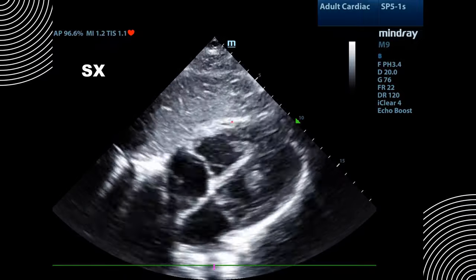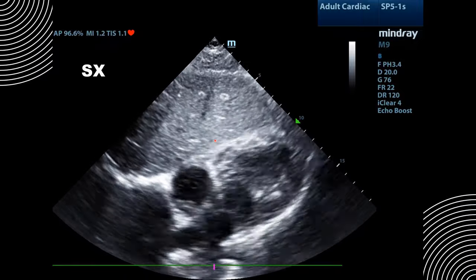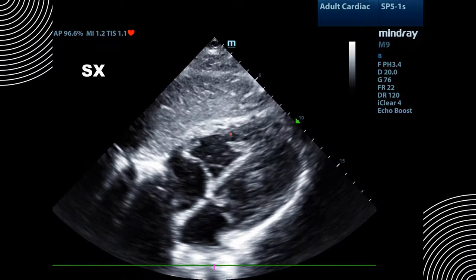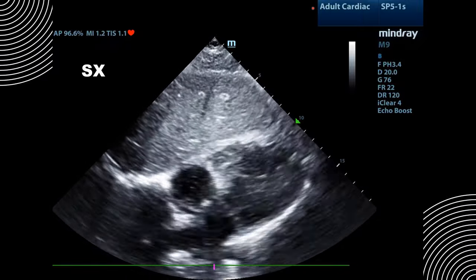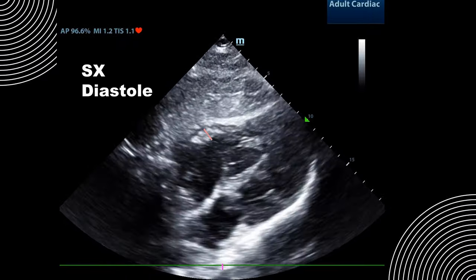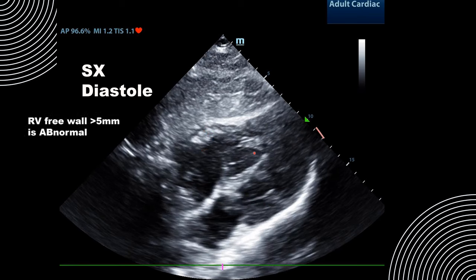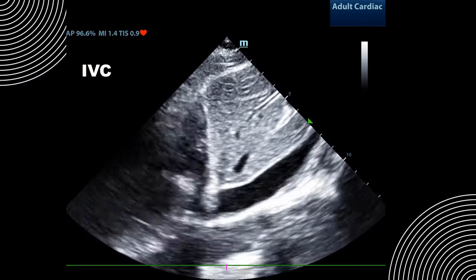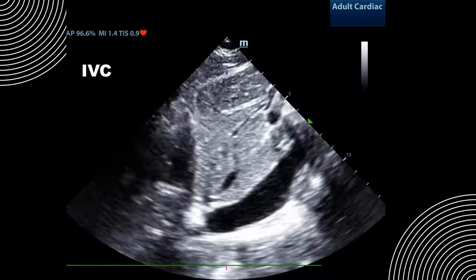In the subxiphoid view, there is no pericardial effusion, but there is one abnormal finding: the thickness of the right ventricular free wall. Pausing in diastole, we measure the RV free wall thickness at approximately 10 millimeters. Anything over 5 millimeters is abnormal, indicating right ventricular hypertrophy. Our last view is the IVC, which shows a plethoric IVC with minimal respiratory variation.